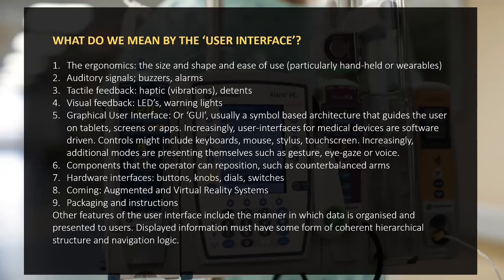James, what's a detent? So a detent would be a mechanical click. Like a spring-loaded ball bearing on a knob. When we test this with users, a lot of old-fashioned analog things actually work better, because you can operate a knob with a detent and a click while you've got your eyes on something more important.